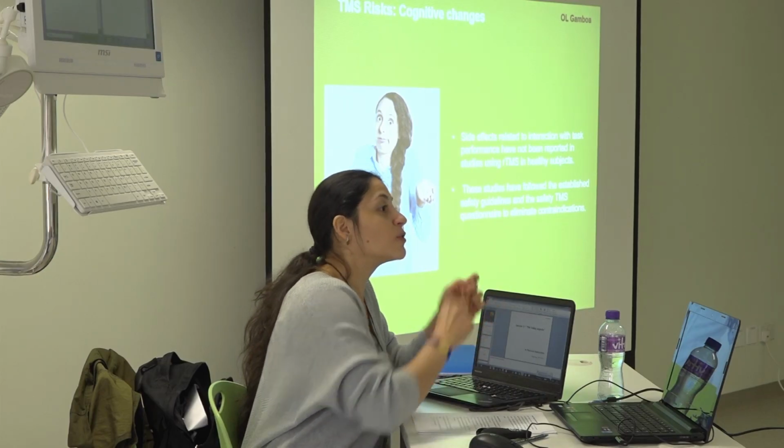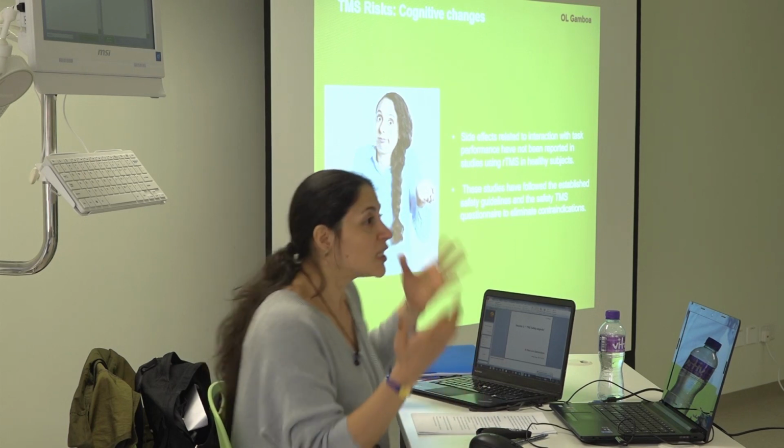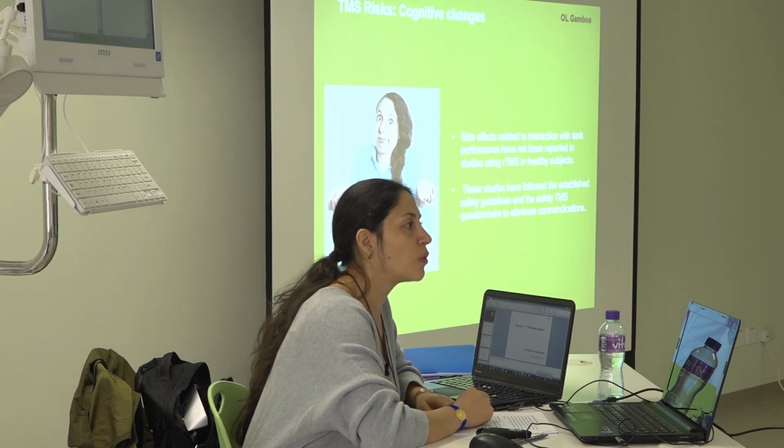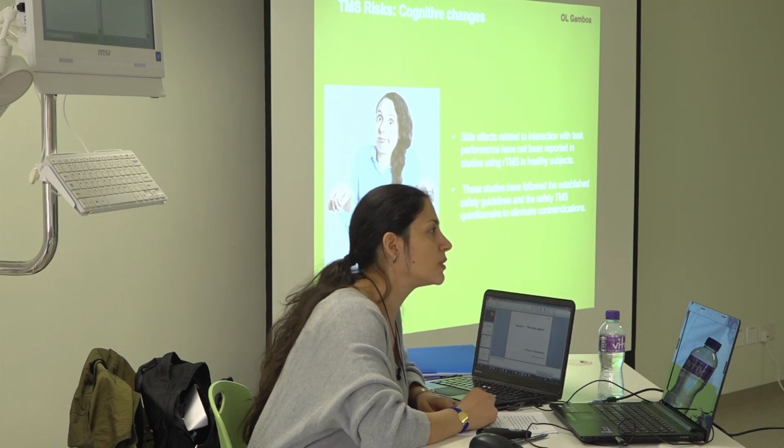if it does, I don't think we would be here talking about this now. We would probably be doing other stuff, stimulating ourselves to become more intelligent or have a better memory. But this is a worry that people have when they come to do a study. They ask, what will it do to me? Because we will see that you can create a virtual lesion. You are going to shut down one part of my brain and I'm not going to be able to think properly? No, it doesn't work like that. I'm sorry, we would really like it to work like that, but it doesn't. So you need to explain that.